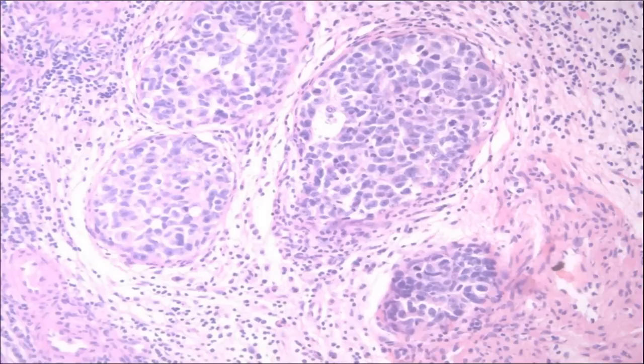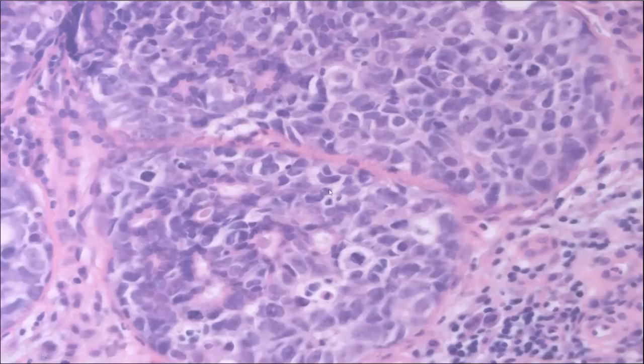Now here's just an example of a case that we had recently, which we wound up calling a sinonasal undifferentiated carcinoma. You can see it's similar to many of the cases that we've already shown: nests of neoplastic cells, markedly atypical, mitotically active, and this wound up to be negative for all of the markers that we have previously discussed.